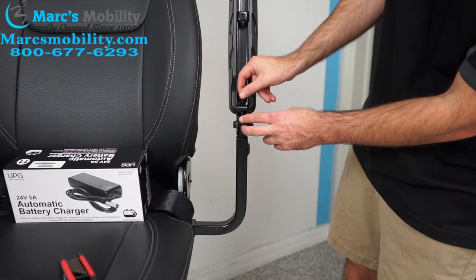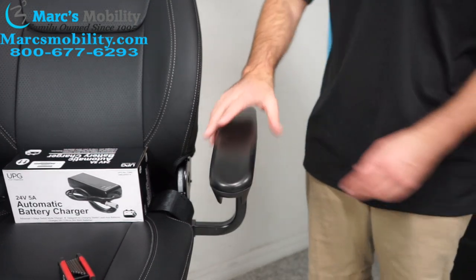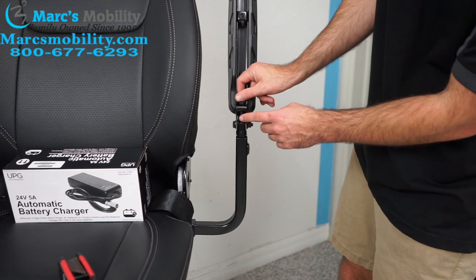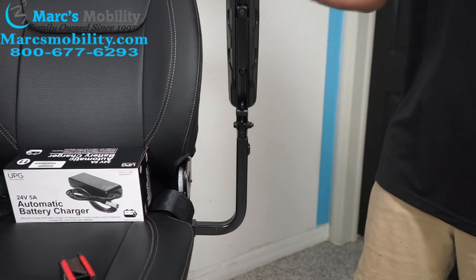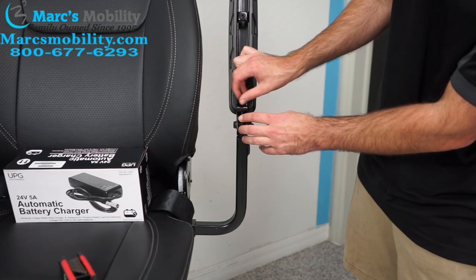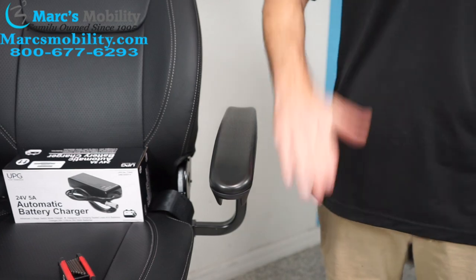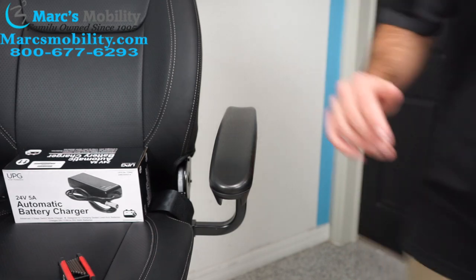I can loosen it some more, and now it's sitting almost level. You can adjust it quite a bit, and then when you're done, just tighten this again so it doesn't come out. Now the arms are level. If you want them to go down, you can screw that screw in, or if you want them to go a little bit higher, you can loosen it.